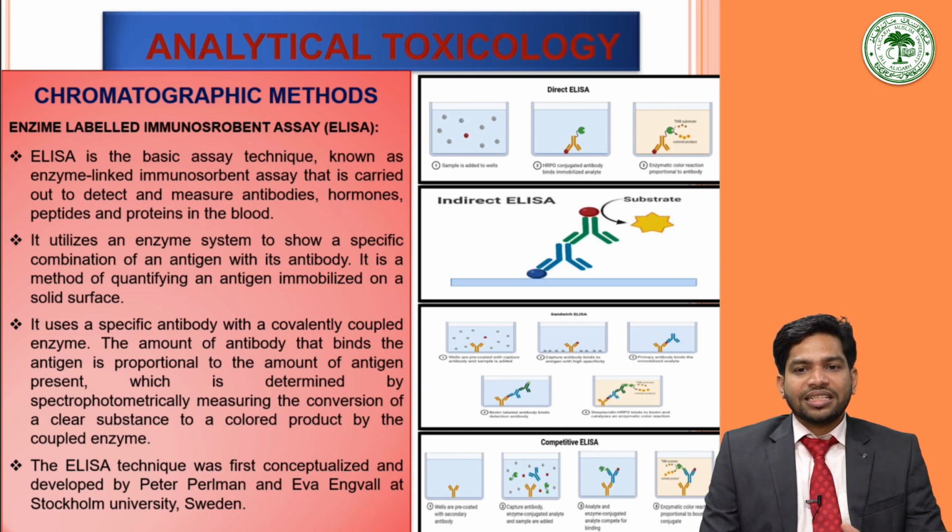The disadvantage of ELISA is that its linear range of colorimetric detection is limited, that is, the depth of color can only go up to a certain extent, and the color development process necessitates additional time, steps and reagents.